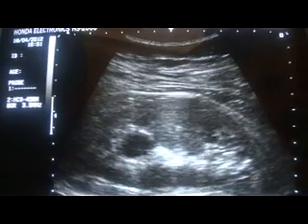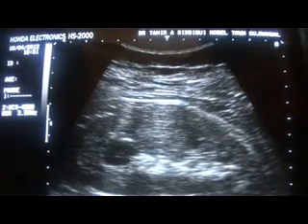For the beginner it is important — now see the difference between the cyst and a pyramid. This is a cyst and this is a pyramid. Anterior to the pyramid, this tiny echogenic spot is the arcuate vessel. So this is a medullary cyst measuring approximately 13.6 by 19.5 millimeters in longitudinal section and in transverse section.